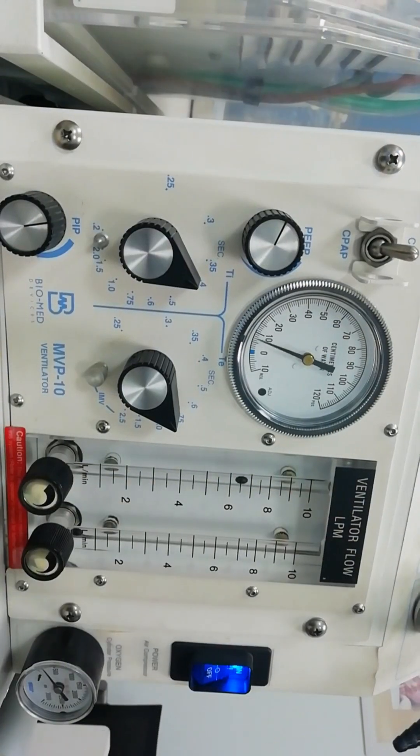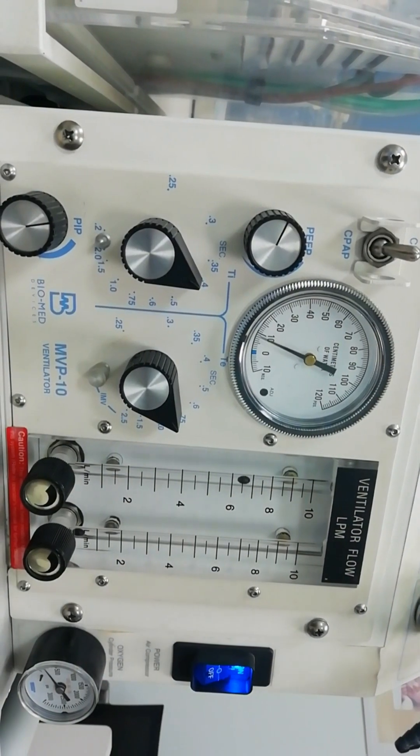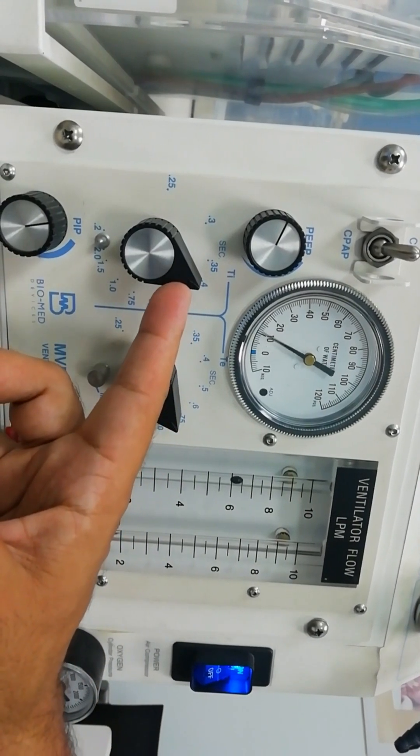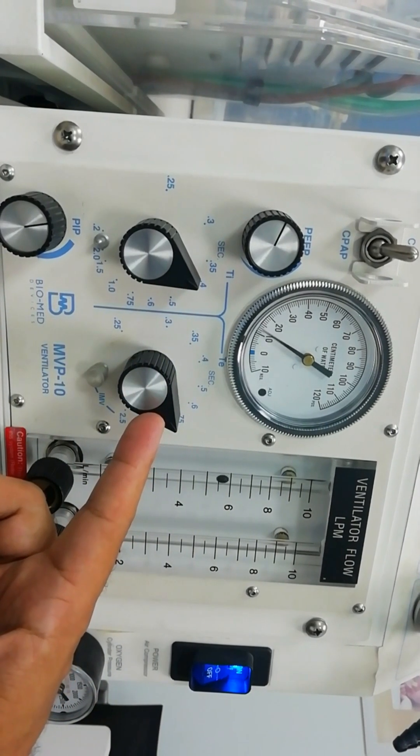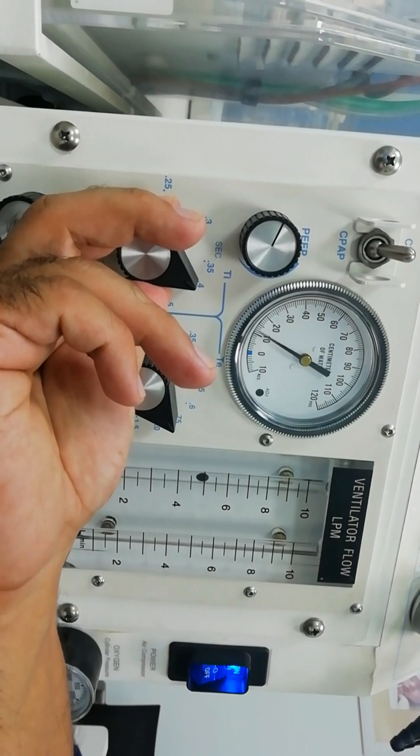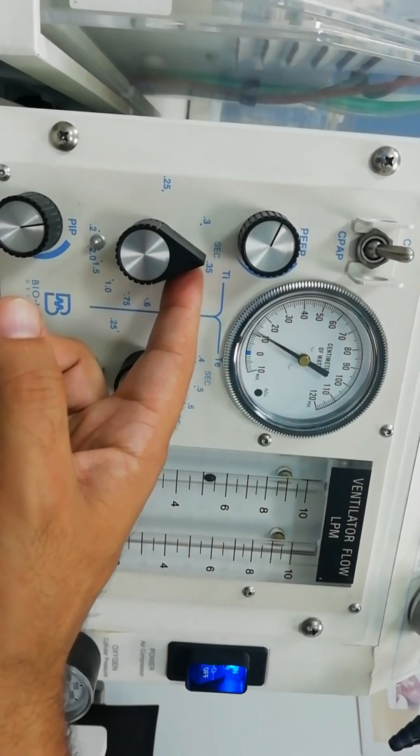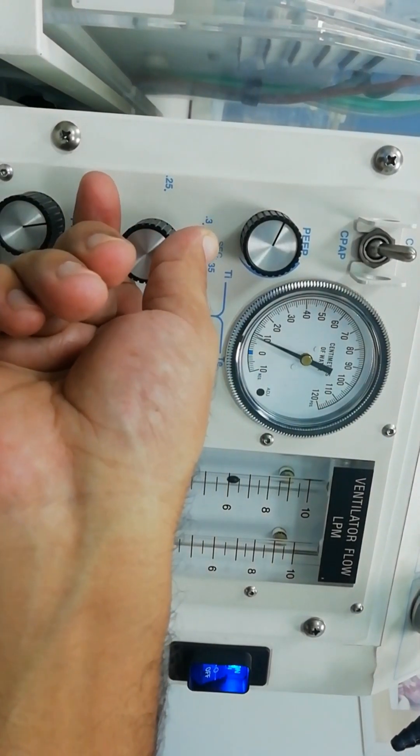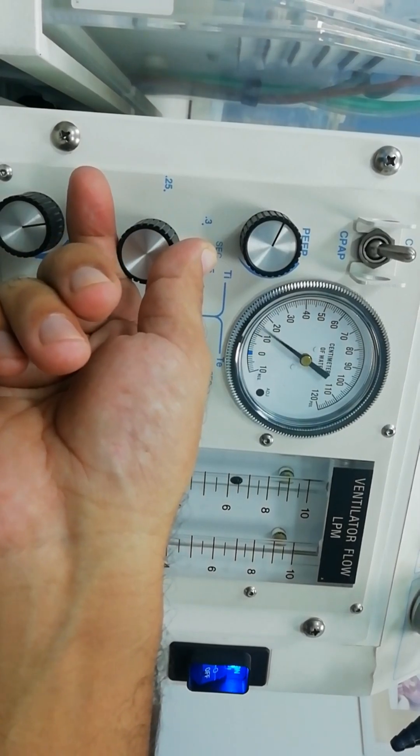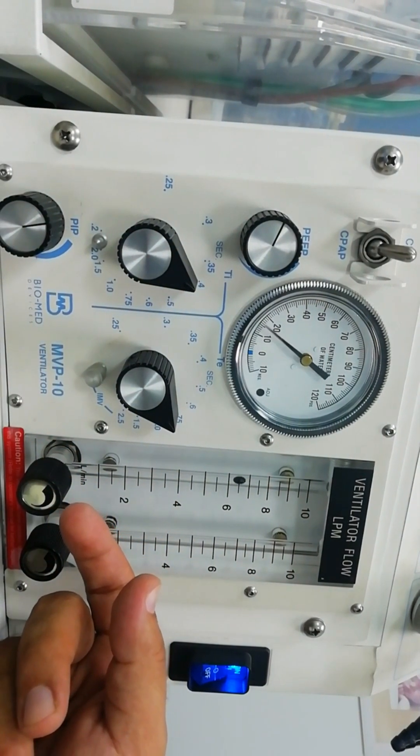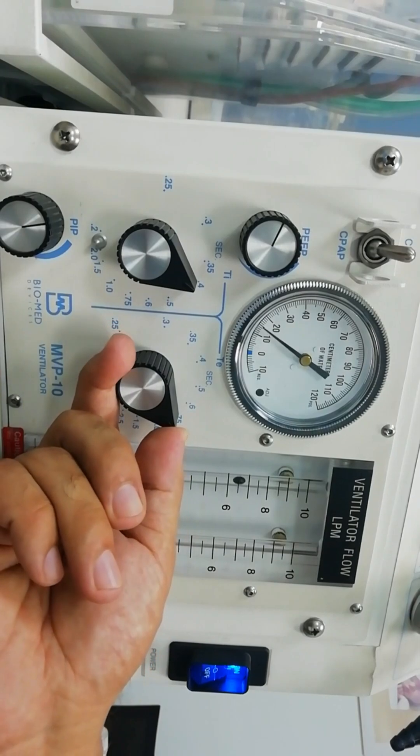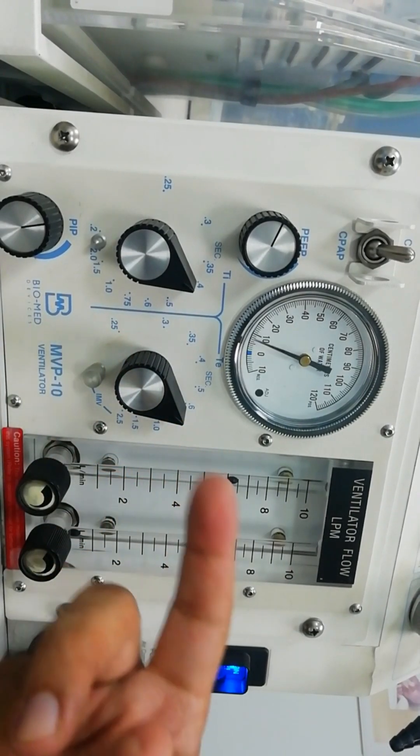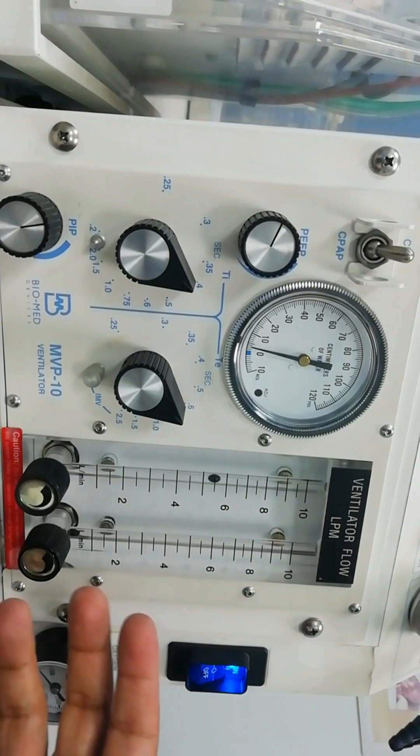To control the respiratory rate we have two knobs. We have the inspiratory time and we have the expiratory time. Usually we keep the inspiratory time between 0.35 seconds to 0.4 seconds. So we can start by 0.4 second and we keep the expiratory time at 0.6. So total we have a cycle of one second. This would provide us with 60 breaths per minute.